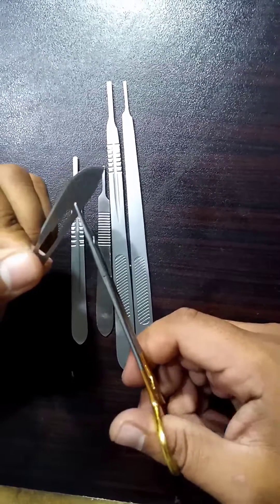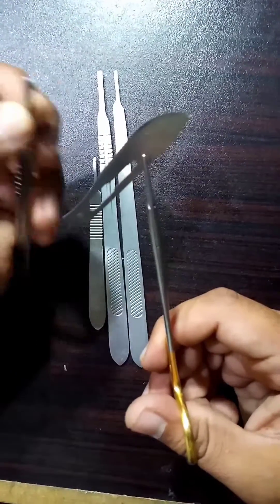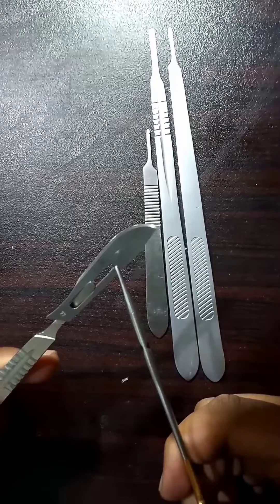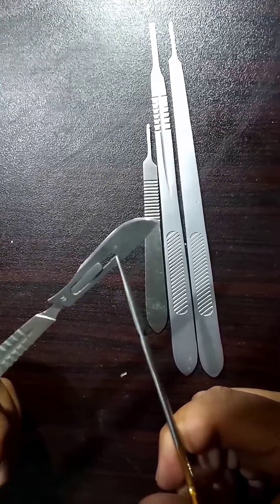Grip the blade with a needle holder or any artery forcep, and hold the handle in your left hand. Continue to slide the blade onto the scalpel handle until it locks in place.